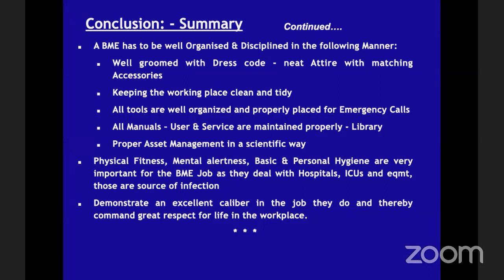Personal hygiene is very important. When you touch the machine for service, you do not know whether it is H1N1 or HIV or COVID, you do not know. So when you are going out for a coffee or tea, you have to sanitize yourself properly. These are ICUs and hospitals, and the equipment is all a source of infection. So you have to maintain your personal hygiene.